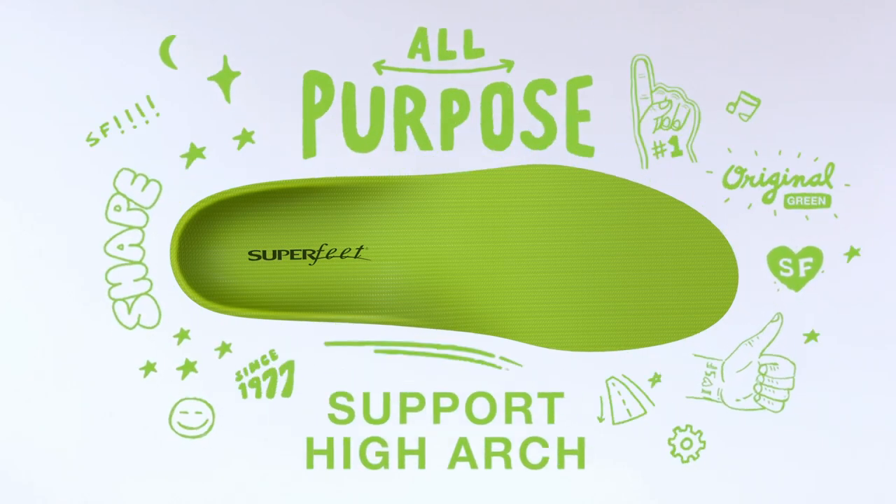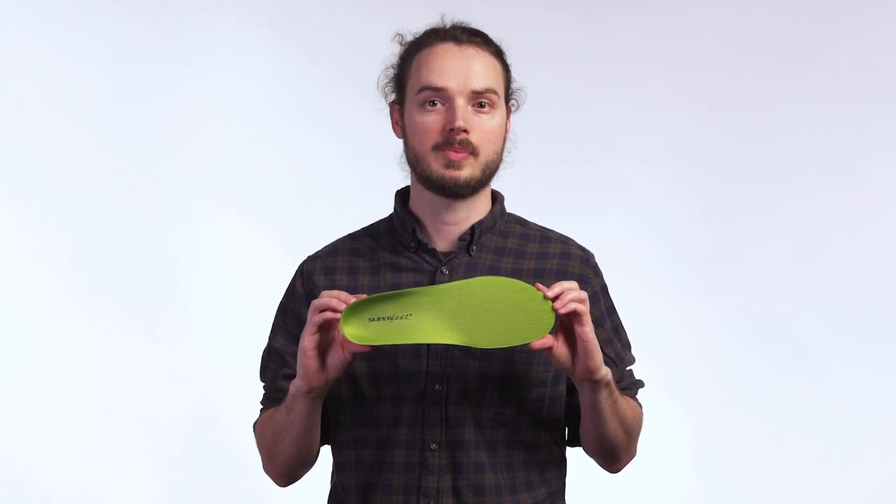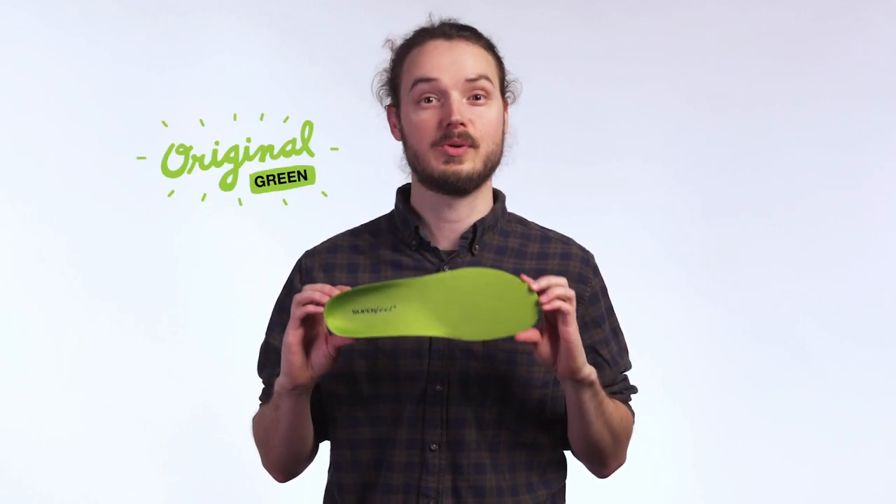Looking for an insole with legendary support, a firm foundation, and a high arch shape? Try Superfeet all-purpose support high arch insoles, also known as the green ones.